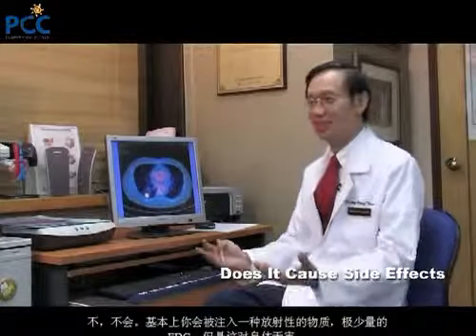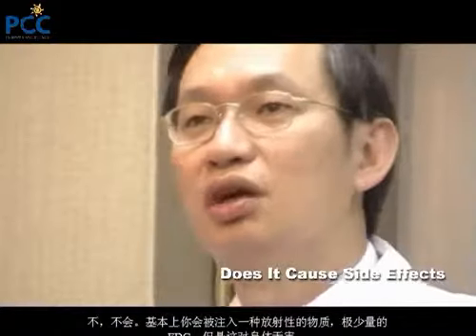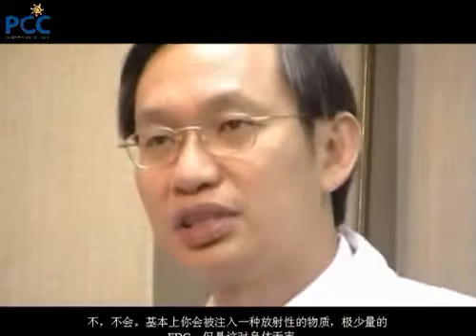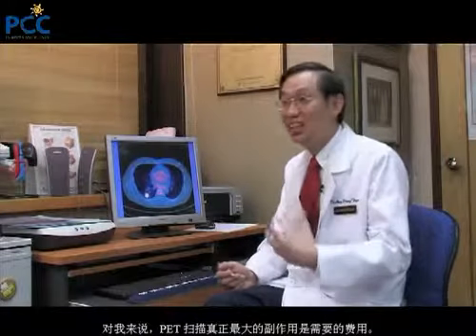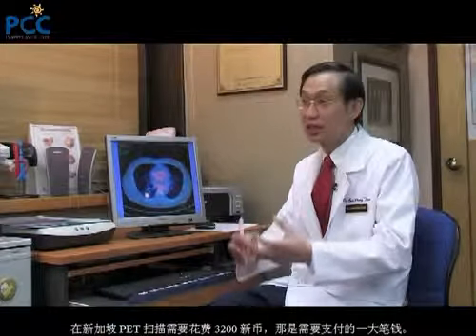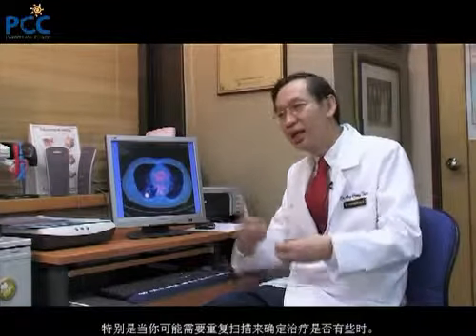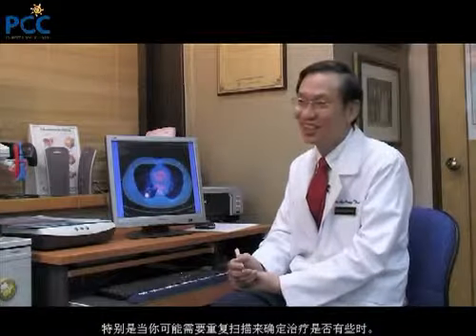No, it doesn't. I mean, basically, you are injecting a tiny amount of FDG, which is a radioactive substance, but it is not harmful to the body. To me, the biggest side effect of a PET scan is really the cost involved. A PET scan in Singapore costs 3,200 Singapore dollars, and that's a big sum of money to pay, especially when you may need to repeat it again to establish whether the treatment is working or not working.